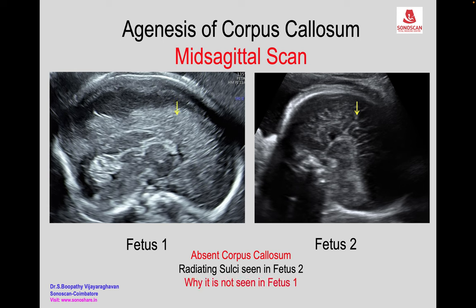Whereas in fetus one, this sign — the radiating sulci or the sunburst sign — is not seen. Why is it not seen in fetus one?